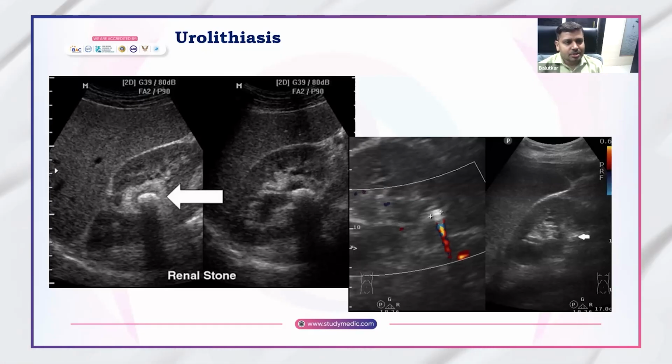We can see it distal to the echogenic focus, which is actually the calcification. So this is not diagnostic, but it is very helpful for diagnosis of tiny calculi. This can be seen also in tiny renal calcifications, and can be seen if there is air within the pelvicalyceal system.